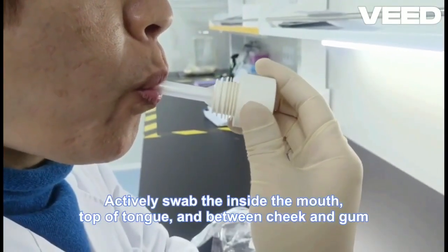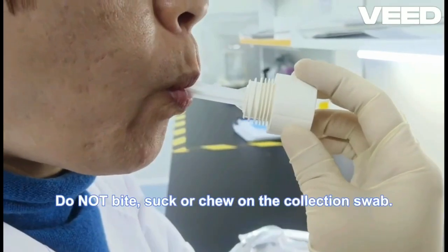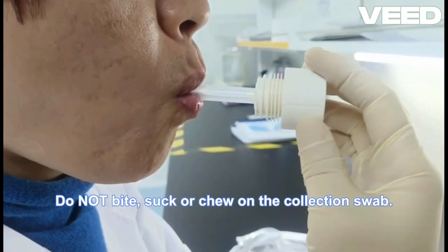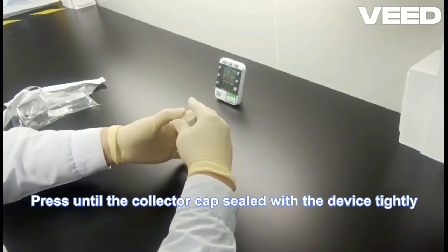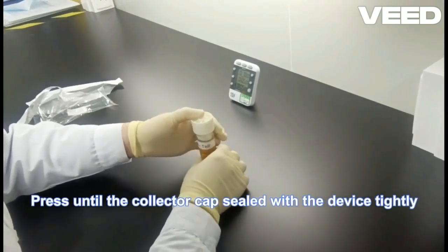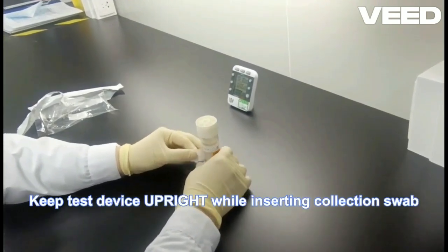The collector will then insert the swab directly into the test cube device. This will ensure that all of the collected saliva will be transferred to the base of the device and make contact with the 8 individual drug strips. This is an important feature of the unique test design. There is no place for the saliva to go, other than be transferred onto the strips. At this stage, the device should be standing upright on a flat surface.